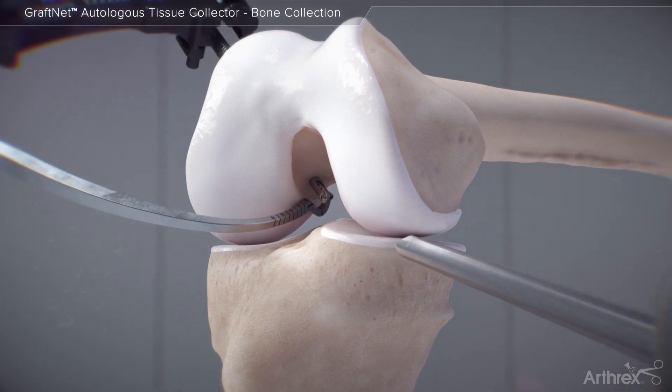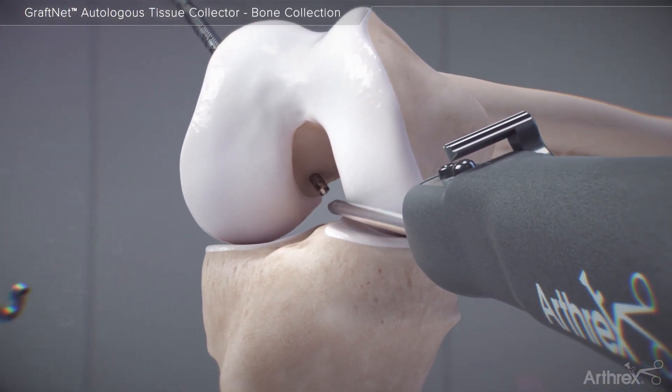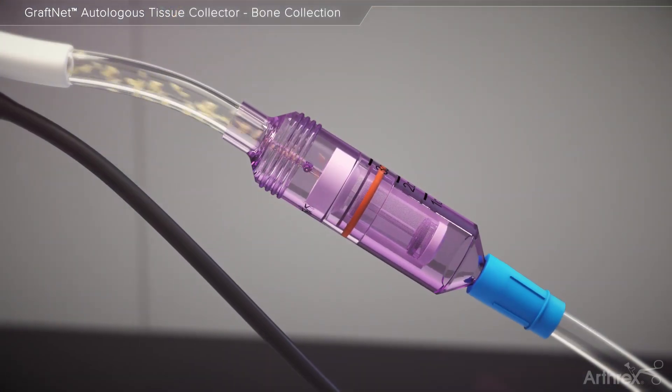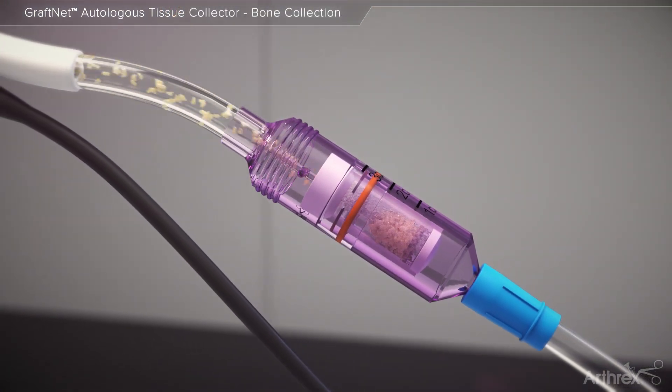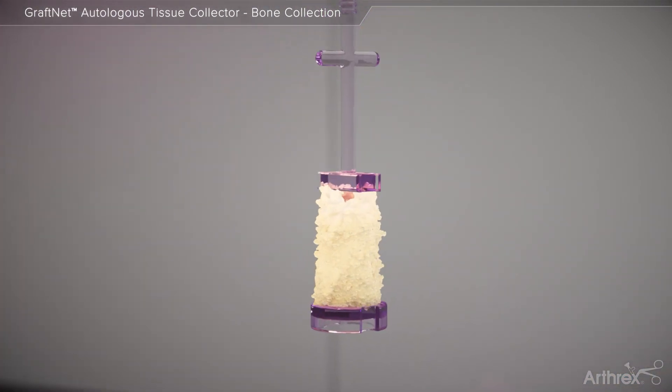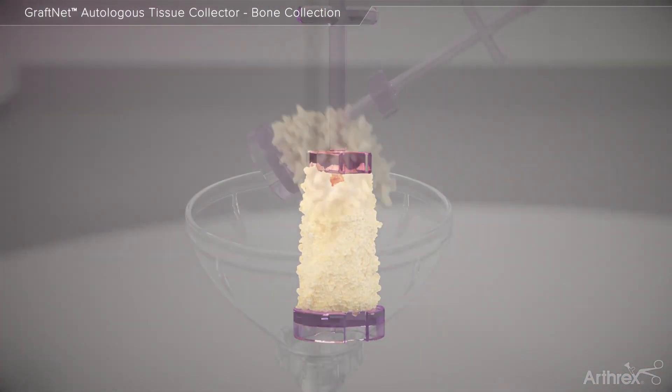During an ACL reconstruction using the FlipCutter device, GrafNet may be used to collect the bone particulate generated when reaming the femoral and tibial tunnels. The autologous tissue is readily accessible within the sterile field when the plunger is withdrawn from the GrafNet device.